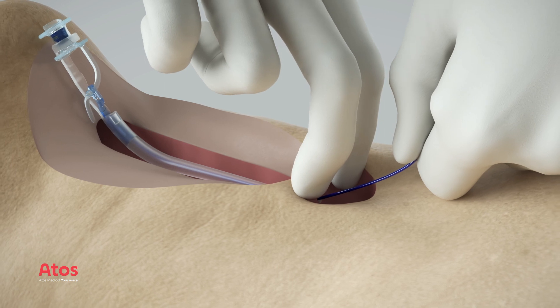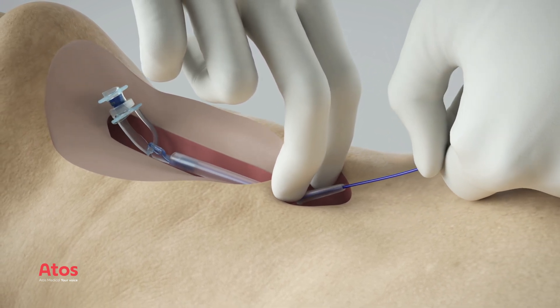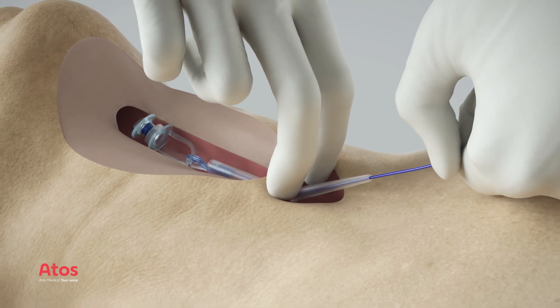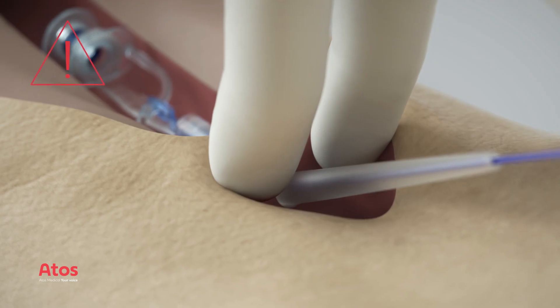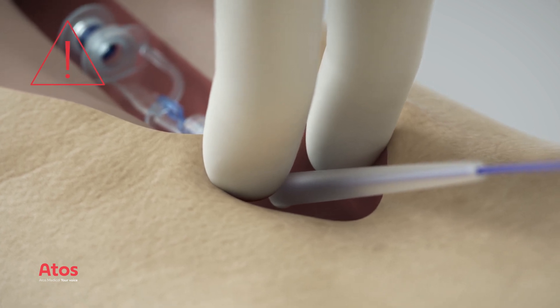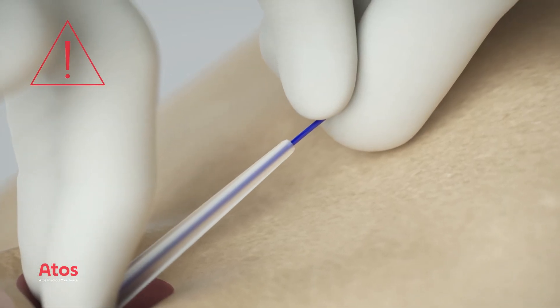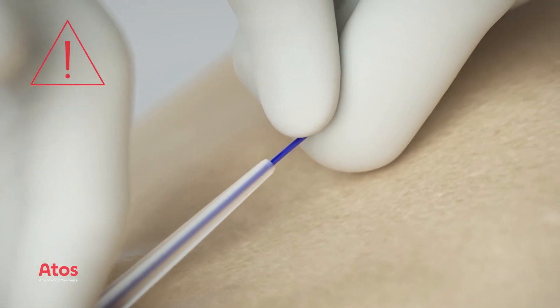Dilate the puncture site by carefully pulling the guide wire until the dilator has passed the puncture site. During dilatation, support the TE tissue to reduce dilatation force. For better control, firmly grasp the guide wire close to the puncture dilator.